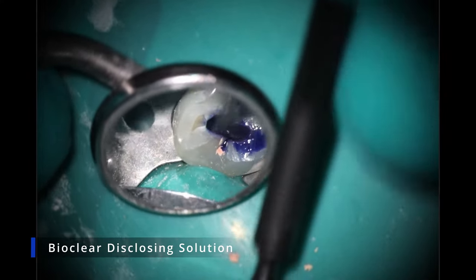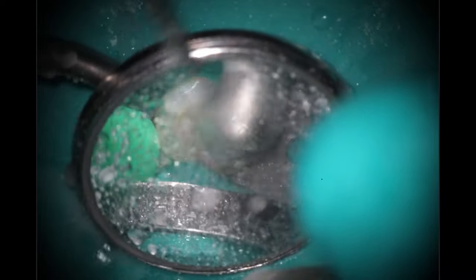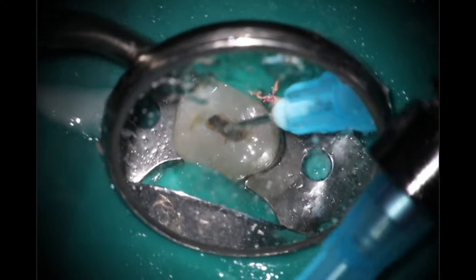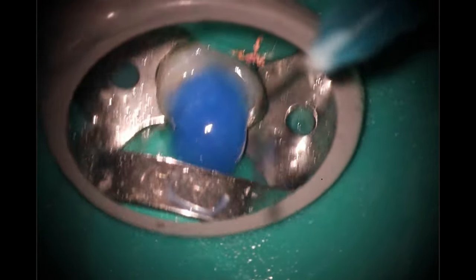Before we do that, I'm going to disclose — this is the BioClear Disclosing Solution, which I talked about in my last video. It gives you a paint-by-numbers approach to figure out where the biofilm is, and then you come in with their little blaster and selectively air etch and abrade the area to make sure you have the best possible bond on this tooth. I switched mirrors here — the BioClear Blaster, even though softer than traditional air abrasion, was scratching my small size-0 mirrors super quickly. I have three mirrors: most of the time I use the size 0, I have a size 5 photomirror from Zurich, and a size 4 for retraction and blasting. Total etch technique for getting this bonding done — letting that soak and rinsing off.